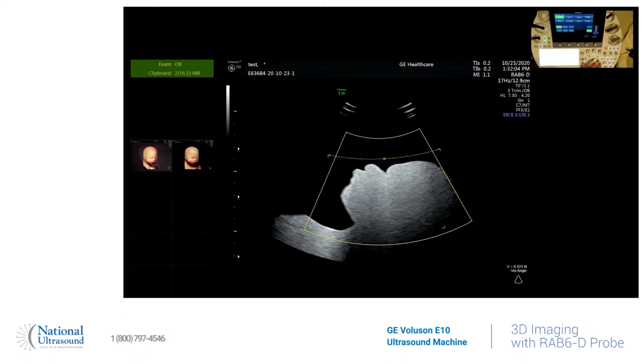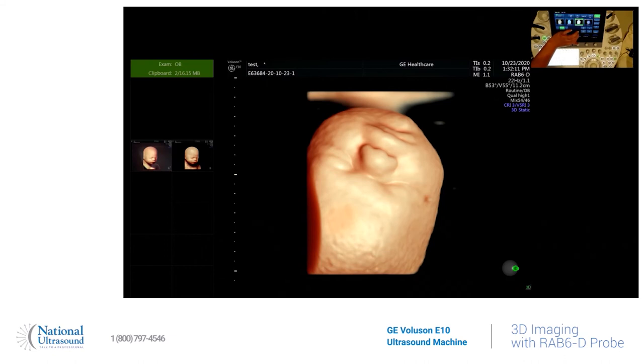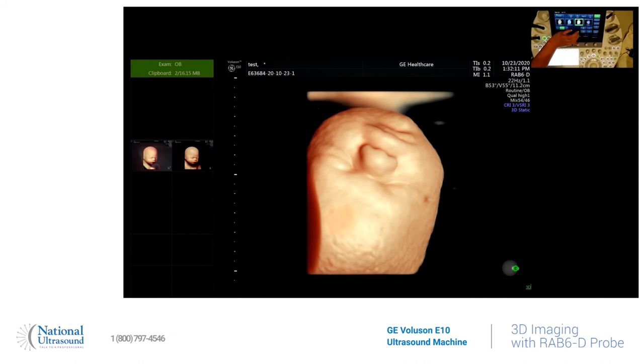Then you right-click next to the ball and you can feel the probe scanning through — and voila, here's our baby! Of course I have it backwards, so you just hit the screen to reverse the image. You move the baby how you like to reveal all the assets. This is how you get a 3D image using the Voluson E10.